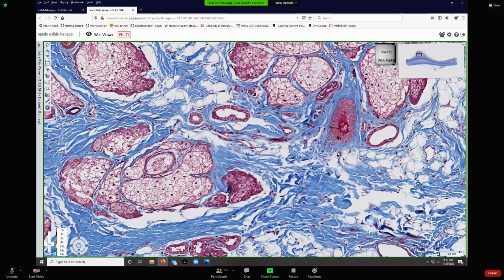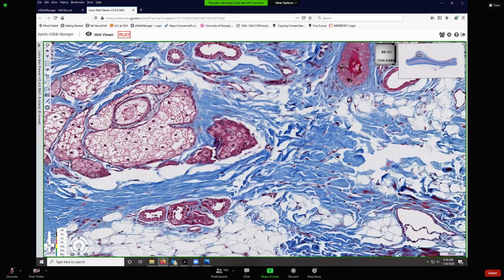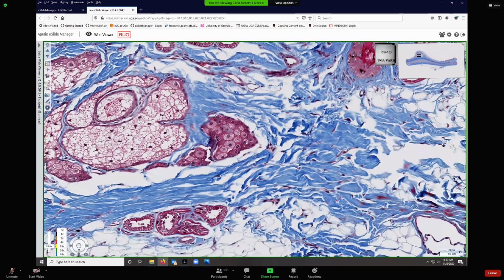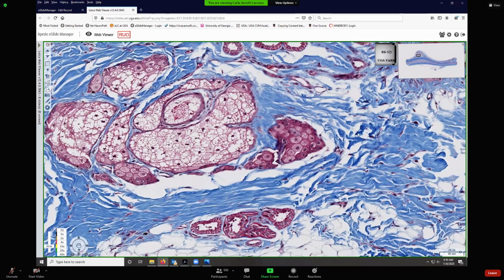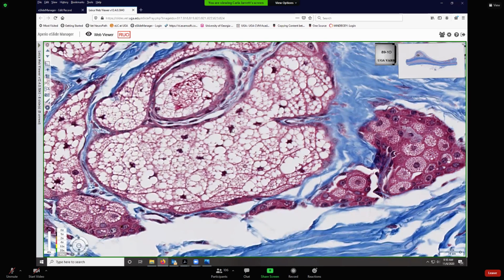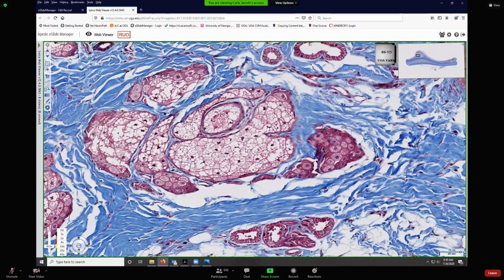Okay, myoepithelial cells. Here are some really brilliant, beautiful cells associated with this sebaceous gland. So you can see how these are your stem cells here. They're starting to fill up with lipids. They're starting to die. Here they have died. They've got pycnotic nuclei, and they're just filled with huge lipid packets.